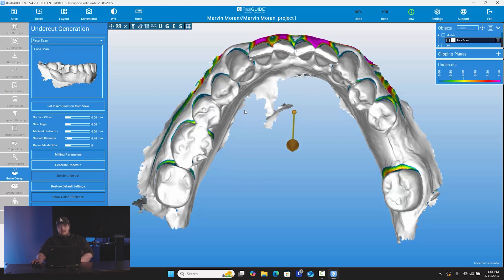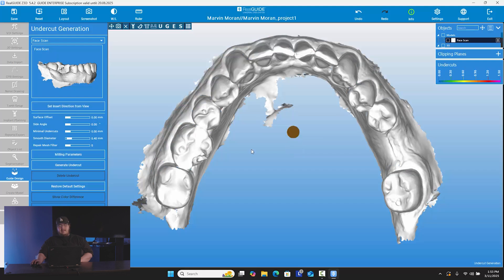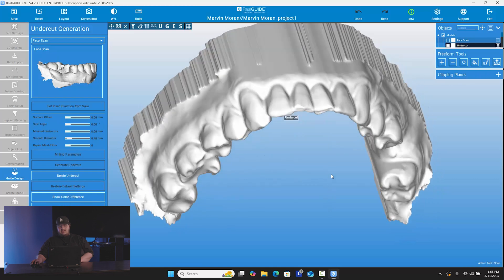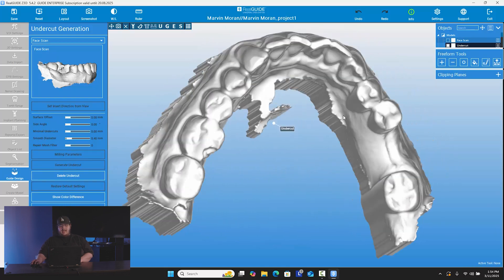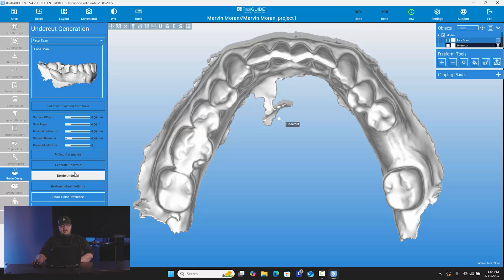Here, what we're going to do is set the undercut. I'm going to get it at the view that I want, and then right here where it says 'set insert direction from view,' I'm going to go ahead and click that. And now after doing that, I'm going to generate the undercut. Now you can see I've generated an undercut model that has filled in all those undercuts, so there aren't any problems when the doctor is actually placing the surgical guide at time of surgery. If you want to delete the undercut and make a new one, you can, but for us we're going to move on to the next step.